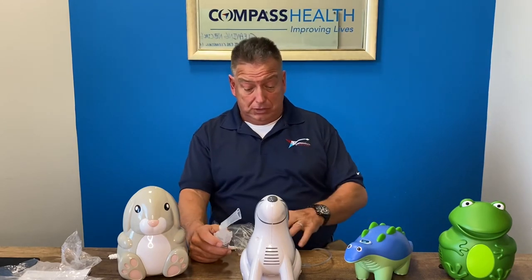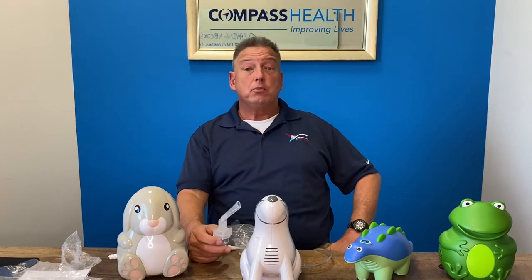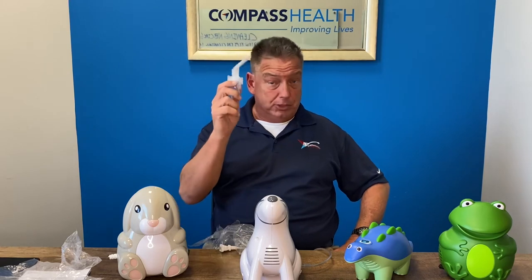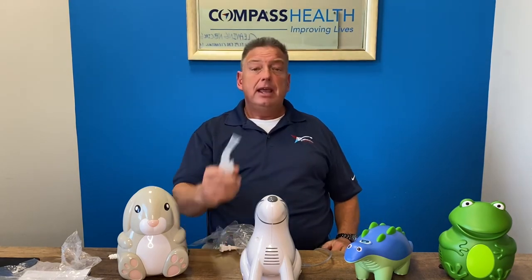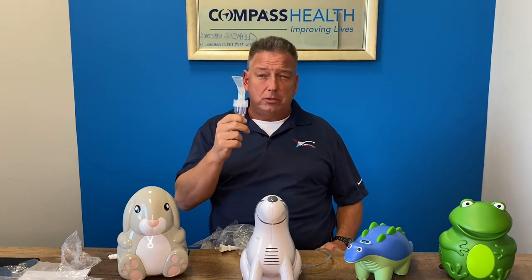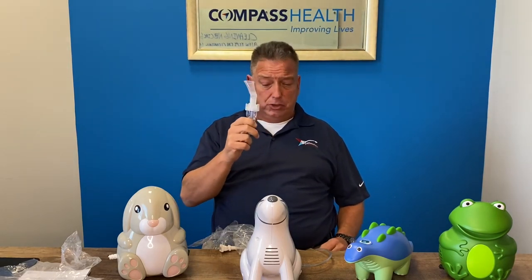With any of the reusable medicine cups that come with some of these kits — the optional reusable ones — those would get replaced every six months as opposed to every two to four weeks. You want to clean them on a daily basis. Every other use, you want to soak these to disinfect and sterilize them. You want to soak them in a mix of warm water and white vinegar solution.